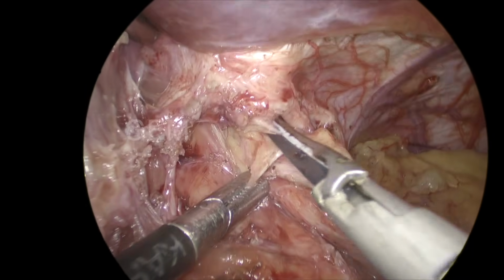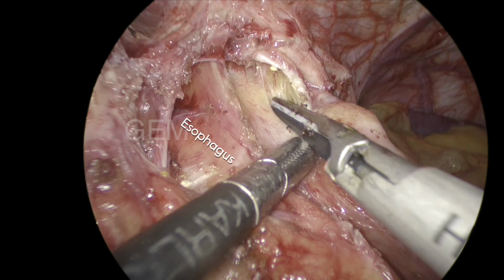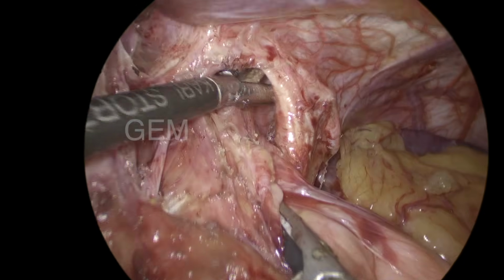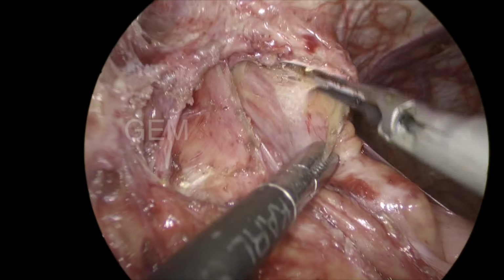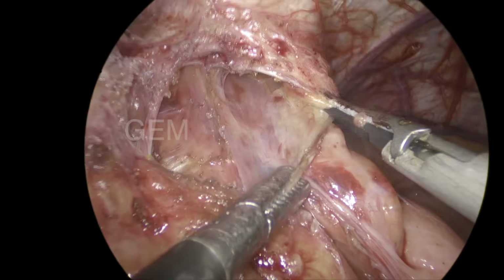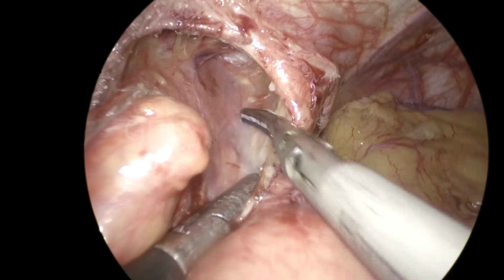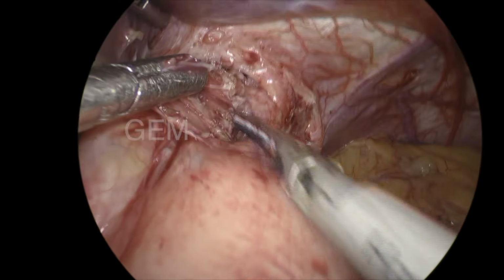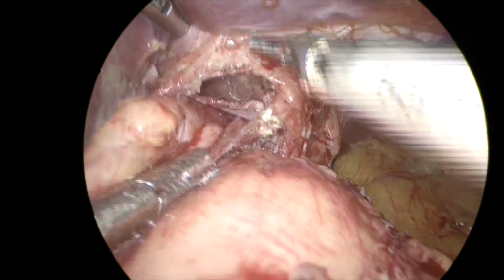See, you can see the sac is going. You have to be careful. That is the esophagus. I am dissecting laterally so that the lateral curve will become straightened when you are taking out the sac. See, now I push the pleura. The sac is coming out now. So without removal of the sac, mobilization will not be completed. That is the excision. I try to excise the sac.